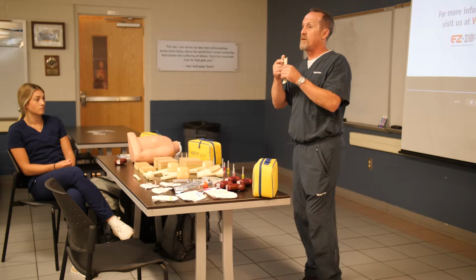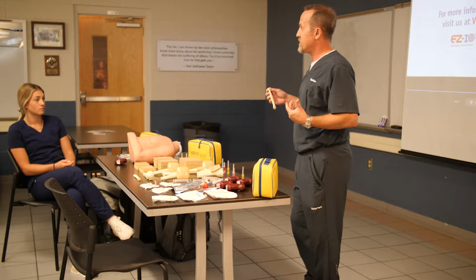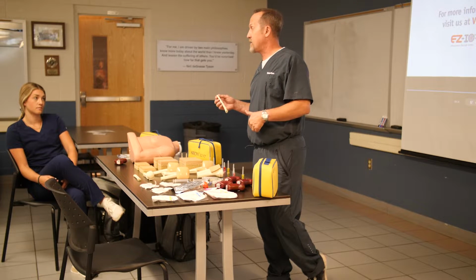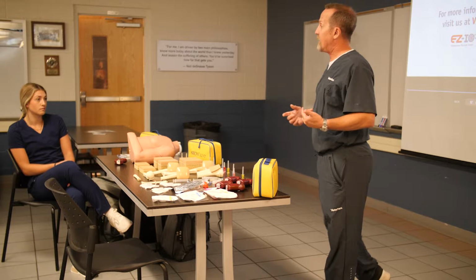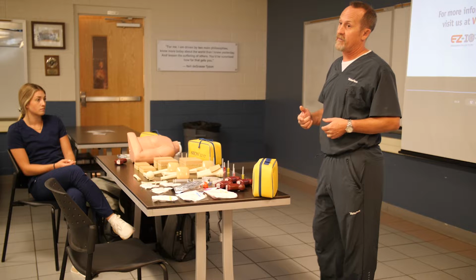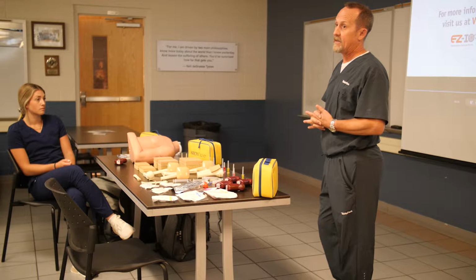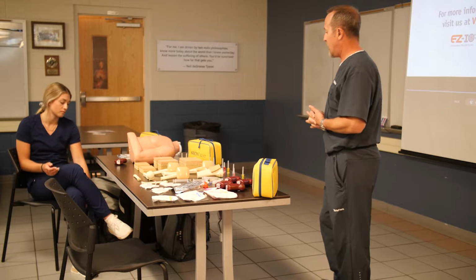I mean, that's an extremely small target to try to hit. The femur is the largest bone in the body. So when you get those really tiny little patients, you're going to have a lot better success rate going into the distal femur, sorry. We have studies that indicate going into the distal femur on a pediatric patient, you have a 99% success rate on your very first attempt, if you're a very first time user of the IO. So pretty significant that you guys can get that spot and have success and get a good flow rate.